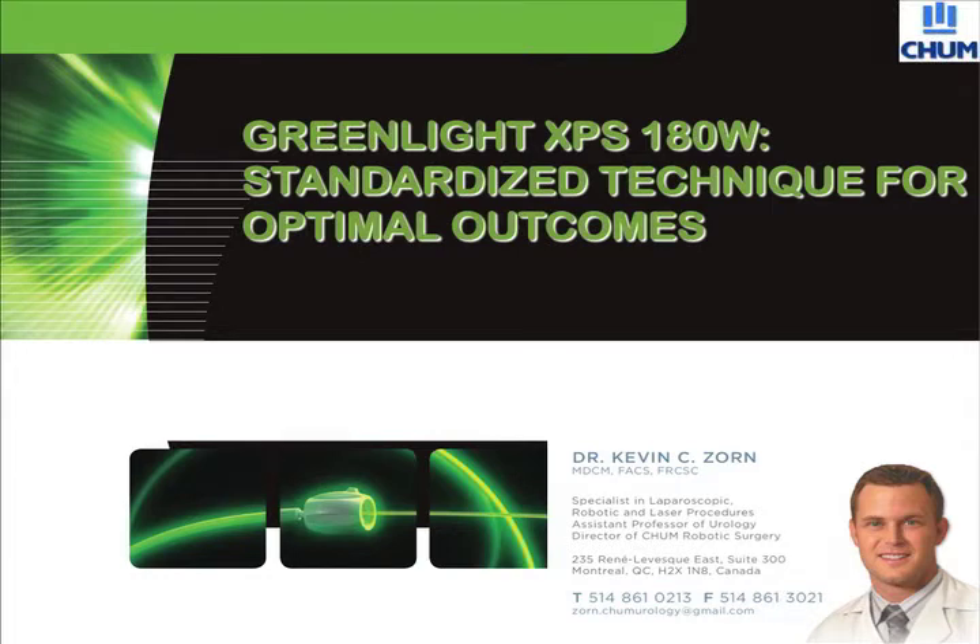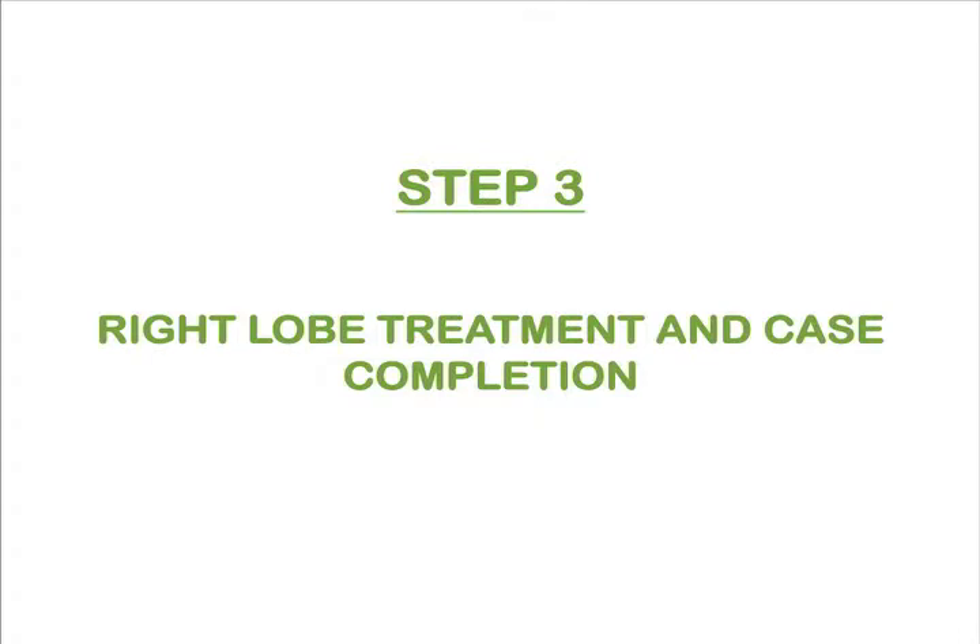Greenlight 180W XPS Standard Technique for Optimal Outcomes, Step 3: Treatment of the Remaining Right Lobe and Case Completion. This educational video will highlight the 12 o'clock incision followed by complete removal of the right lobe and case completion. Here we see the continued vaporization technique with rotational and retrograde movement of the fiber toward the verumontanum to debulk the large sized right lateral lobe.